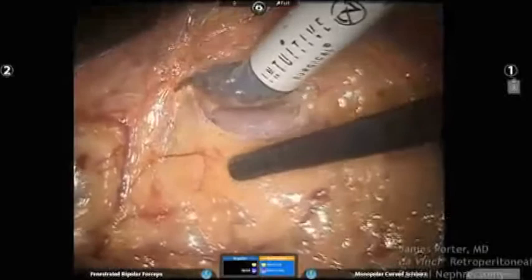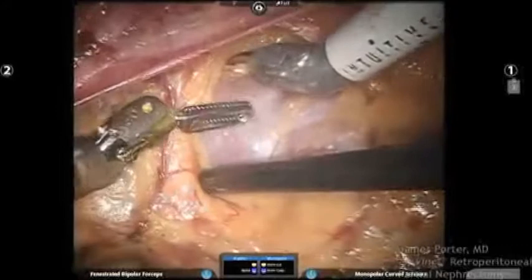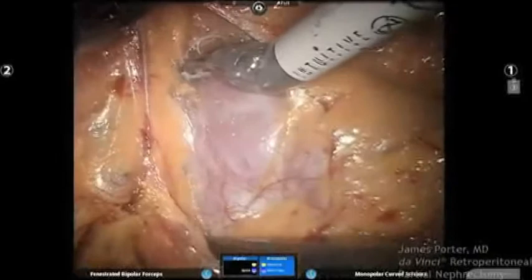You know, I would say that some people run into the problem of not being able to find the tumor, especially an endophytic one like yours. Yeah. So a couple questions. One would be, do you use ultrasound? And if so, do you think you should use it all the time? And the second question would be, any tips?